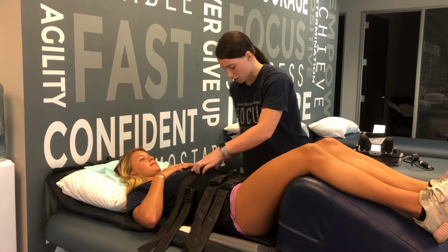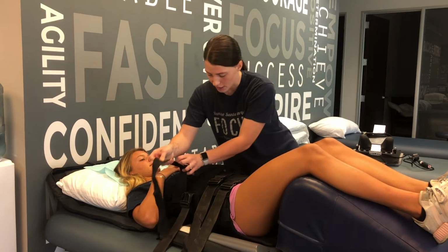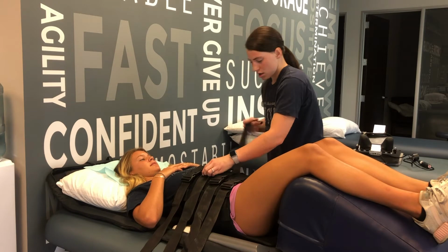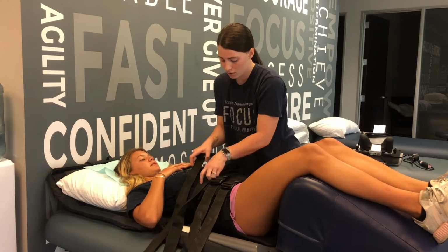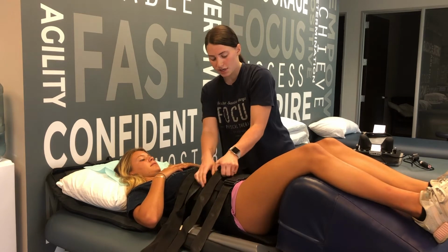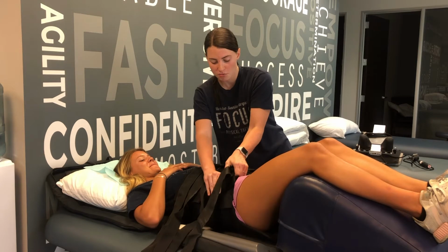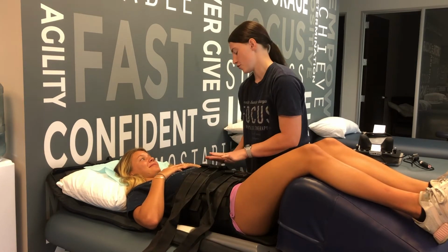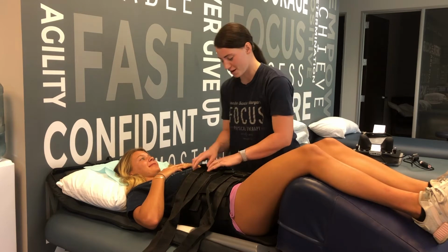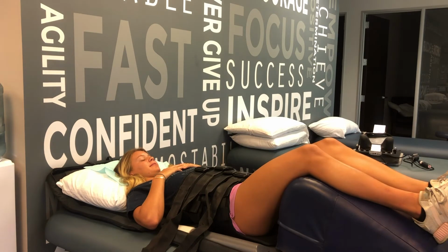I usually just start with buckling the loops where they're not super tight, just kind of all connected, and then I go back through and tighten them all. They want to be pretty snug. Obviously you don't want to be preventing the person from breathing, but they do have to be pretty tight to get that traction. So if it gets too tight and you can't breathe, let me know. Shouldn't get that tight.